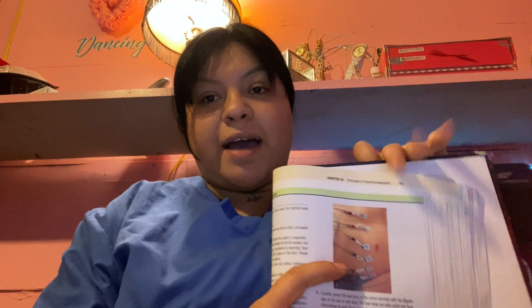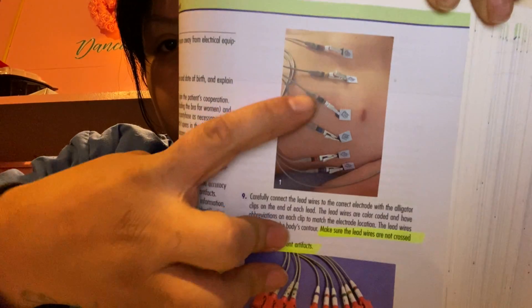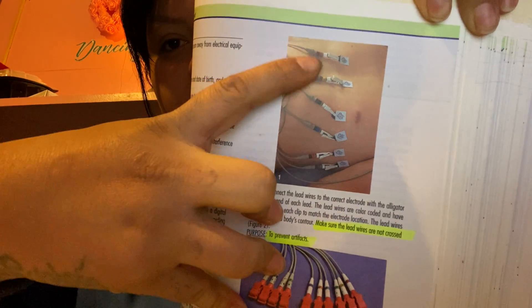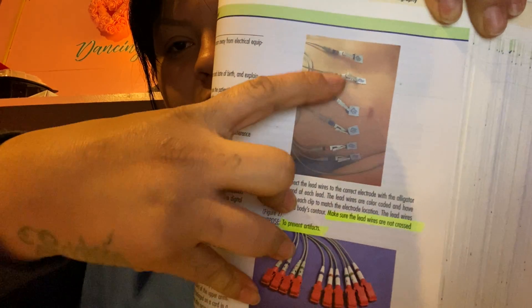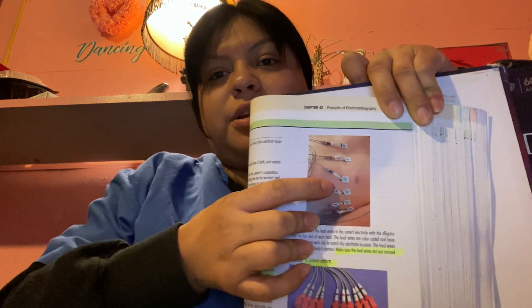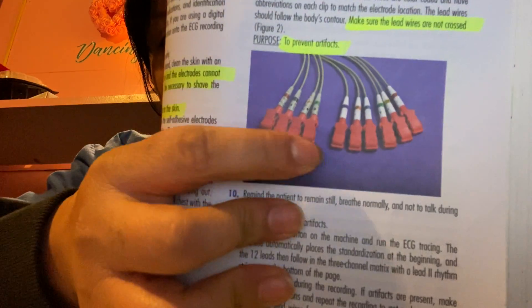So now this is what it's mostly going to look like — I have my book here. These are the self-adhesive electrodes and these are the lead cables, and that is part of the EKG machine. There's also an EKG machine shown here — these are what the electrodes look like.